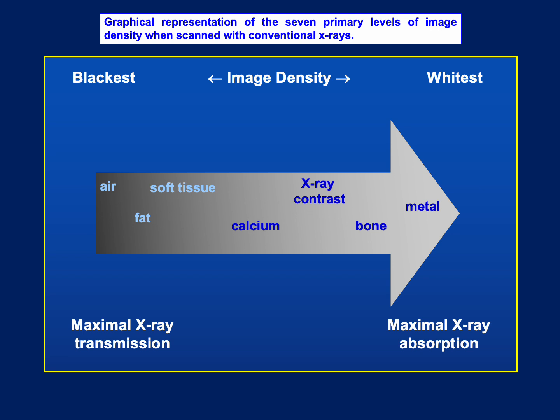Another way to think about this is to think about X-ray transmission versus absorption. Higher density substances will absorb more X-rays. They appear brighter, but they also become warmer or hotter as they absorb X-rays. Conversely, lighter materials will transmit more X-rays and hence appear blacker on X-ray pictures.